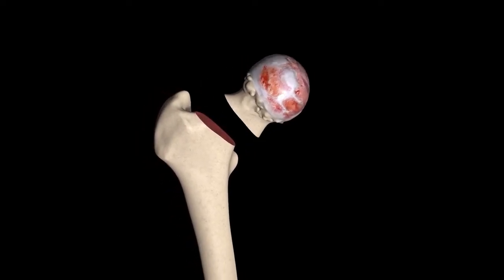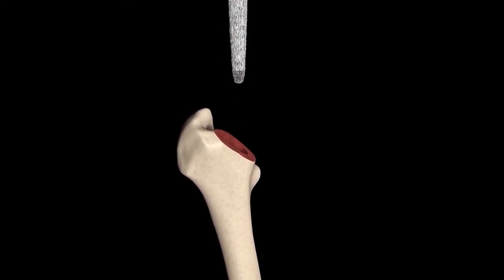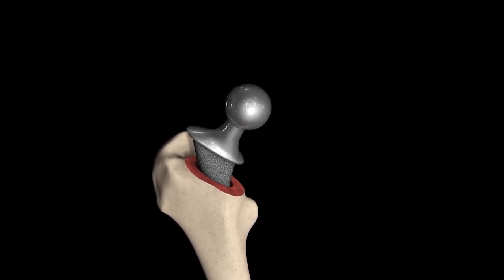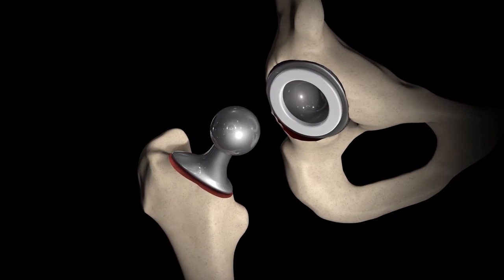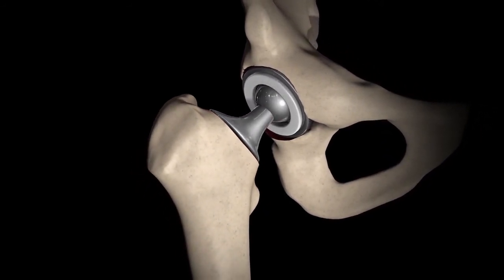The next step is to address the thigh bone side, or the femoral side. The femoral head is already gone, so you prepare the femur itself to accept a femoral component. The femoral components now are relatively small and narrow, and can fit easily into the top portion of the upper femur. A ball is then attached onto that femoral component, and that ball is reinserted back into the socket. And that's a hip replacement.